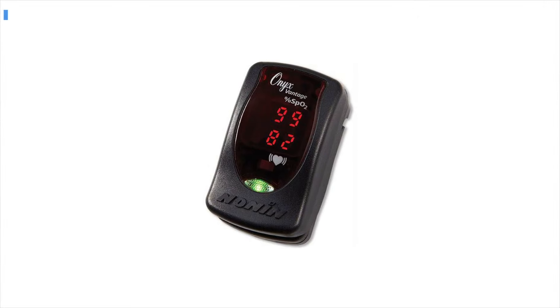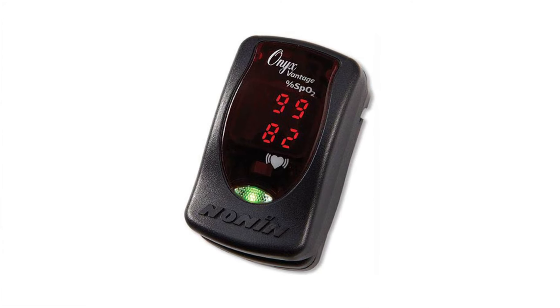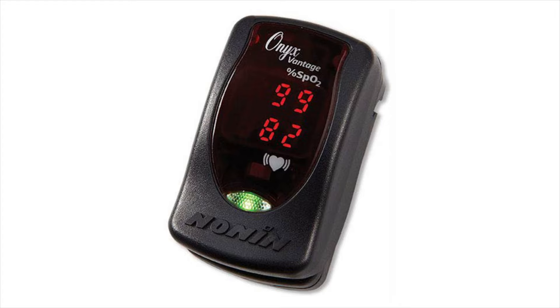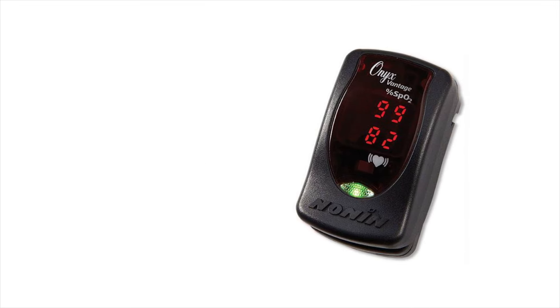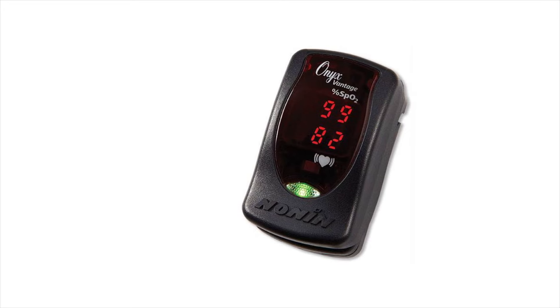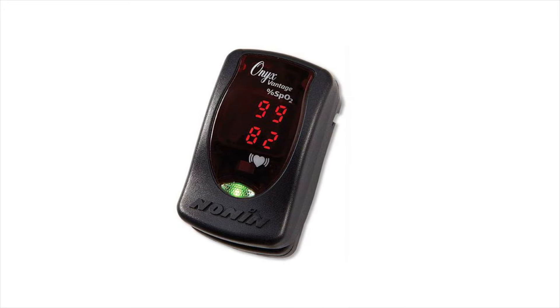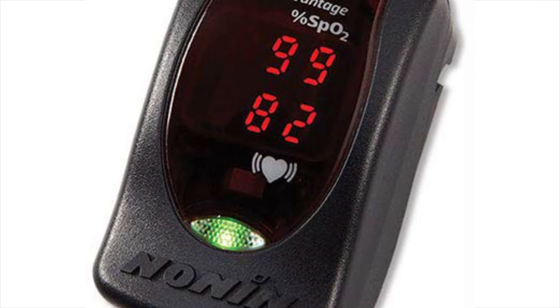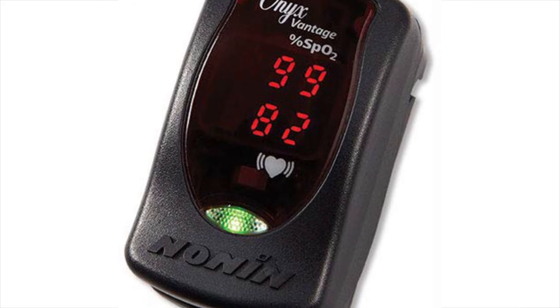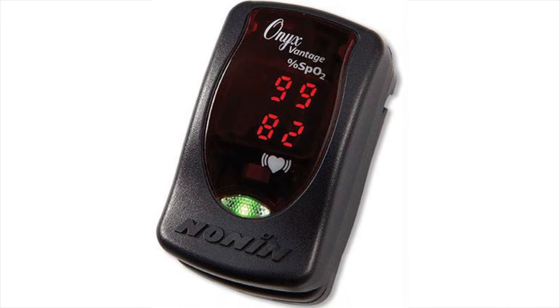In the runner-up position, we feature the Nonin Onyx Vantage 9590, the prime choice among premium offerings. The Nonin Onyx Vantage 9590 is a medical-grade pulse oximeter known for its high accuracy. It has been extensively researched and compared to arterial blood gas readings, which are considered the gold standard in blood oxygenation testing. The results showed a strong correlation, making it a reliable option for measuring oxygen levels. In our testing, it consistently provided rapid results, with an average response time of just over 3 seconds.